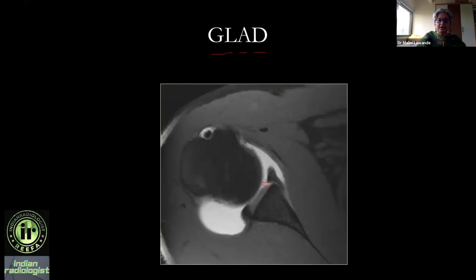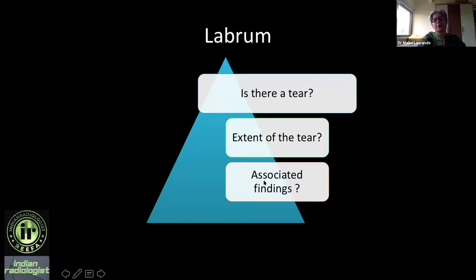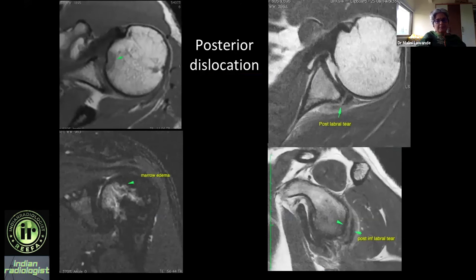If you don't use the term ALPSA, just say anterior inferior labral tear displaced medially — that's fine. Has a part of the adjoining cartilage also come off, creating a glenoid articular cartilage defect? If so, describe the anterior inferior labral tear with that cartilage defect size. Are there any associated findings? Yes, here there is also a posterior labral tear.